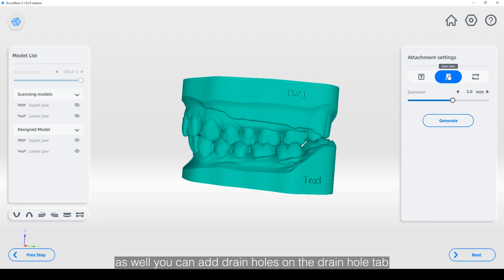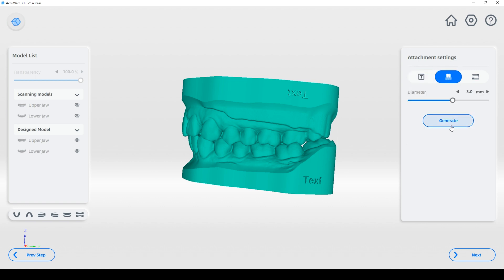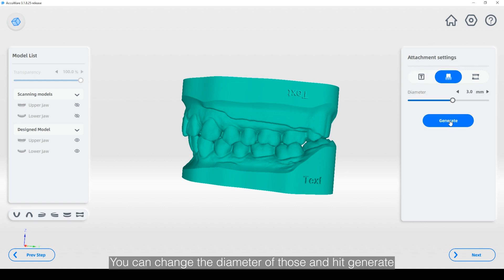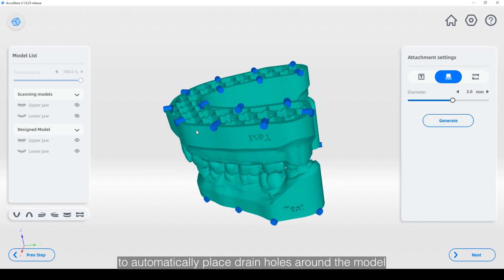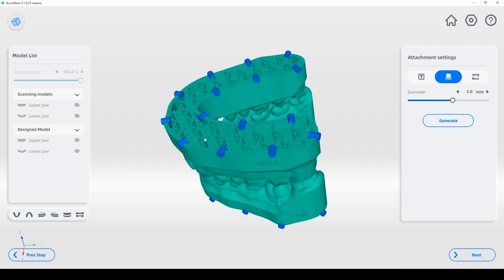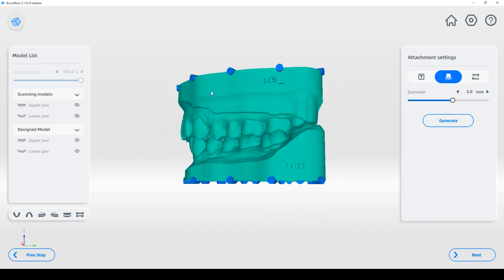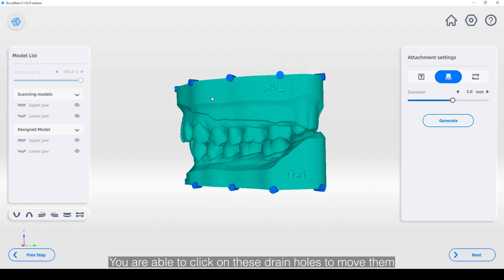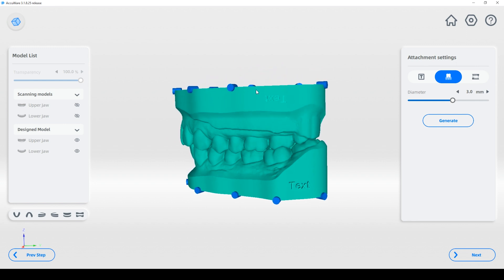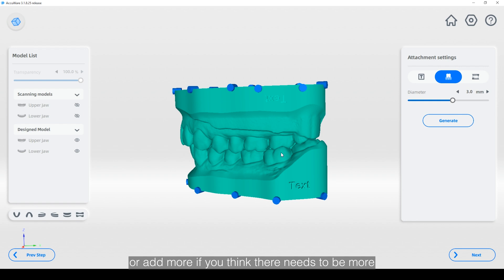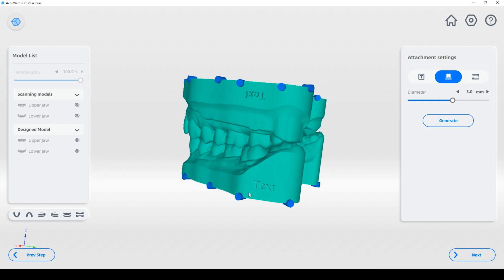You can also add drain holes on the drain hole tab. You can change the diameter of those and hit generate to automatically place drain holes around the model. You are able to click on these drain holes to move them, or add more if you think there need to be more.